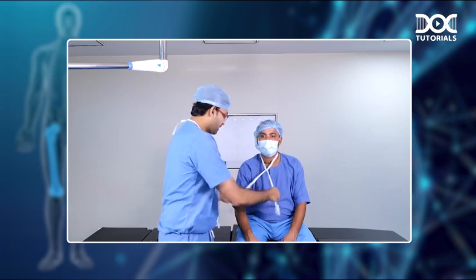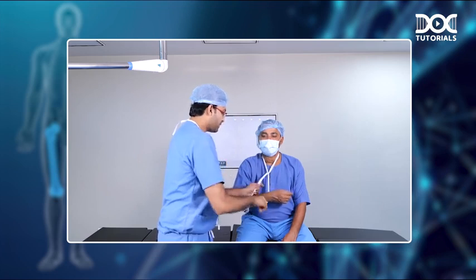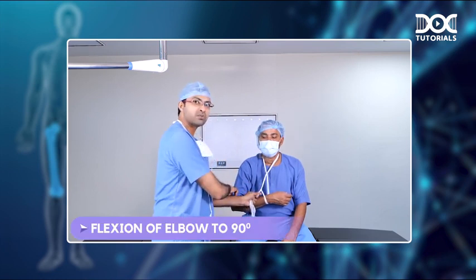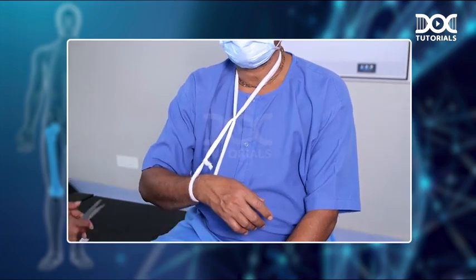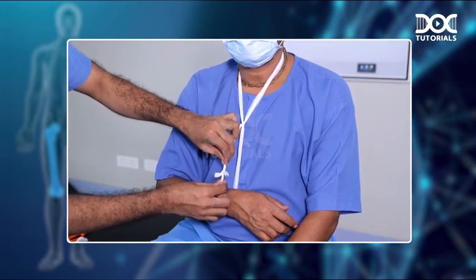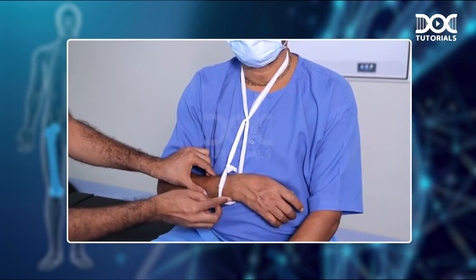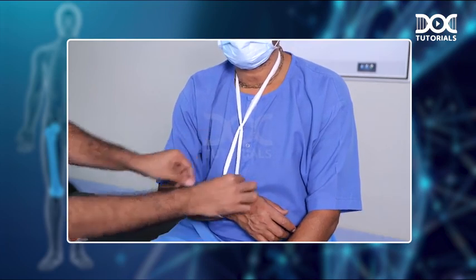Then next you can ask the patient to flex the elbow like this. Then you put a knot around the forearm and secure it. Make sure that the elbow is flexed to 90 degrees. Now whatever excess bandage you have, you can cut it off. Make sure the patient is comfortable and look at the position of the knot here. I have purposefully put the knot here and not at the base. What will happen if you put the knot there? The knot will dig into the patient's skin and it will be very uncomfortable. So make sure you put the knot either in front or back.